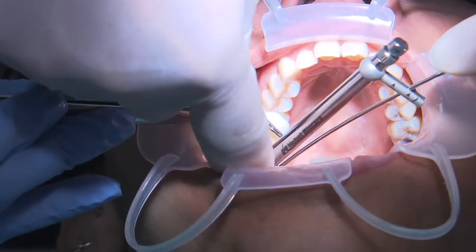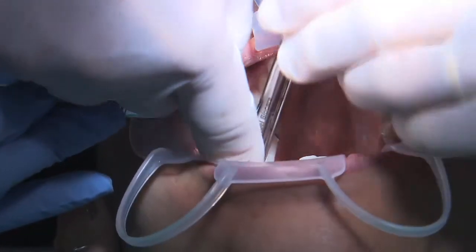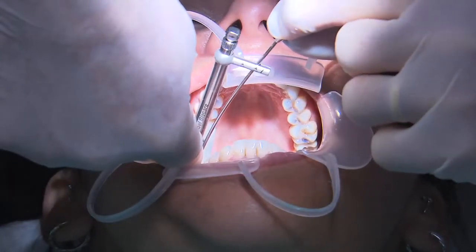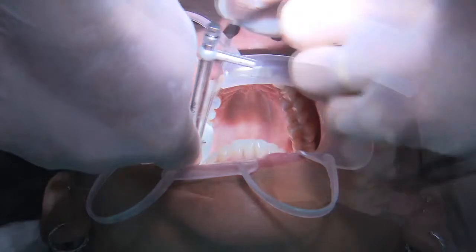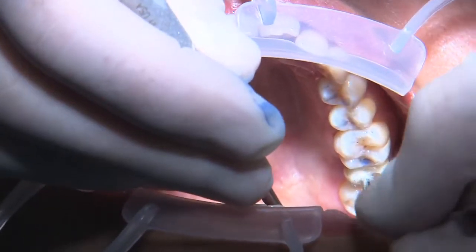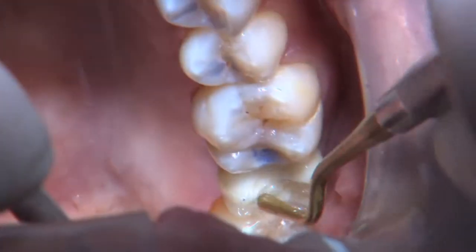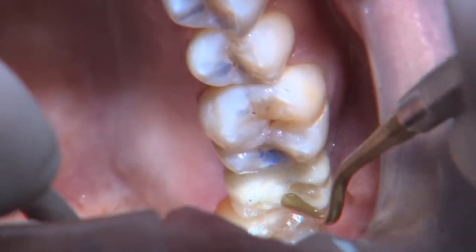One technique to achieve the recommended torque is to tighten the screw with the torque wrench, wait 5 to 10 minutes, then re-torque it. A cotton pellet or piece of gutta percha is then placed over the head of the abutment screw, and the excess opening is sealed with composite.